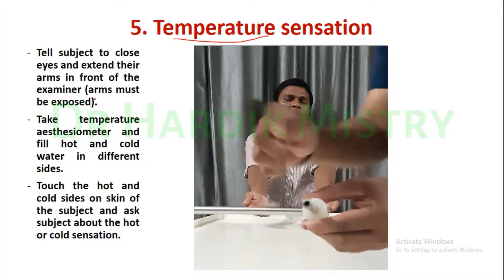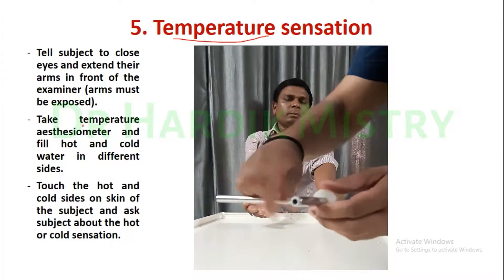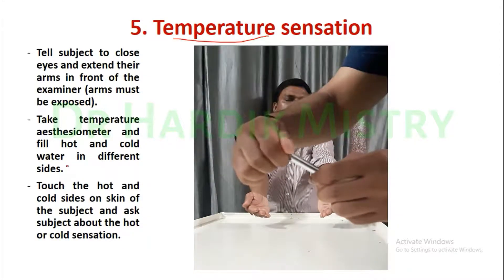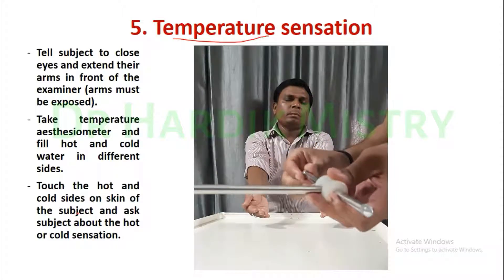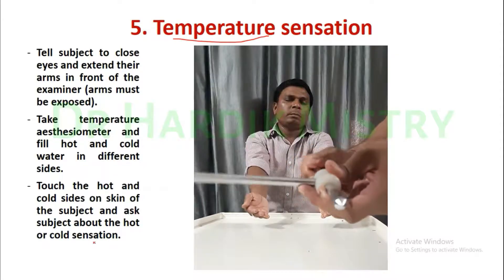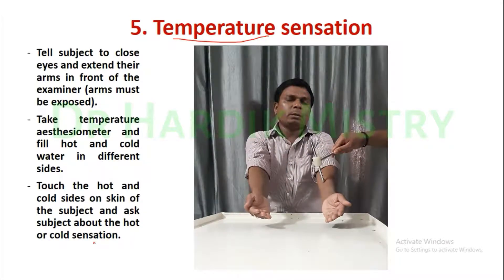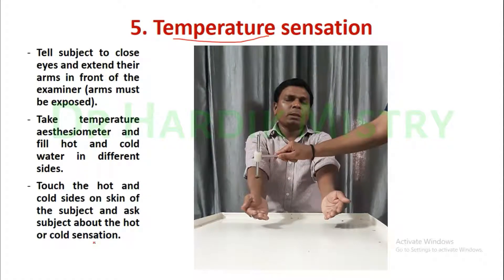Arms must be exposed. Take a temperature aesthesiometer and fill hot and cold water in different sides. Touch the hot and cold sides on the skin of the subject and ask the subject about the hot and cold sensation. Then check whether your subject is right or wrong.